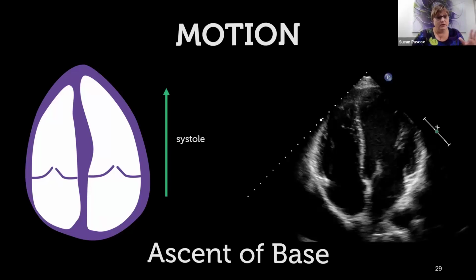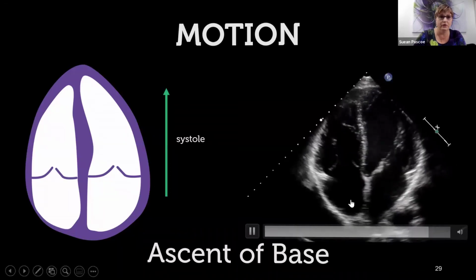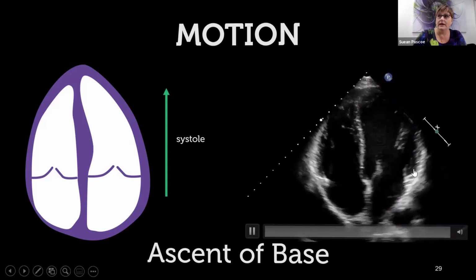And that's great if you want to put a number on it. But if we practice getting used to looking at the B mode, you can actually tell a lot from the B mode. So here is the normal heart motion, and we're looking at the motion along the vertical axis, in particular, looking at the movement and the motion here of the valve annulus.